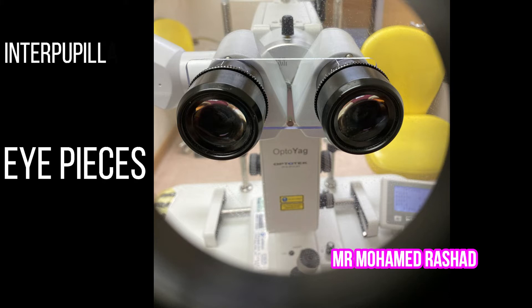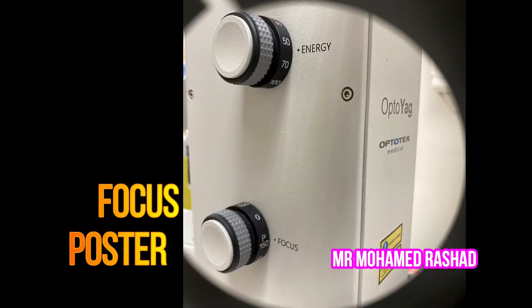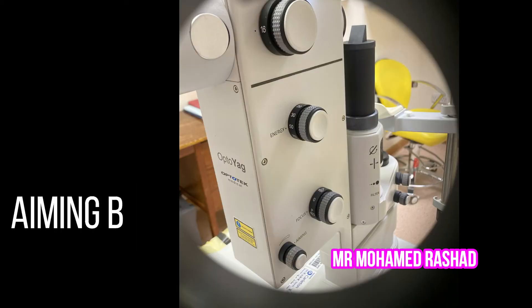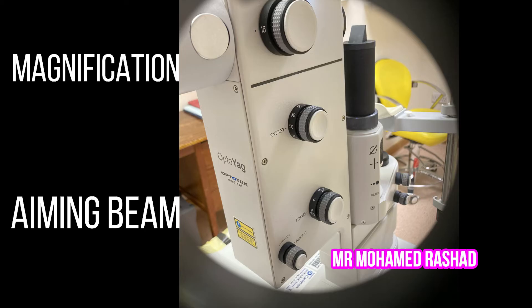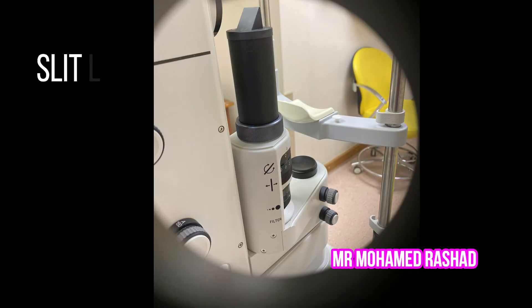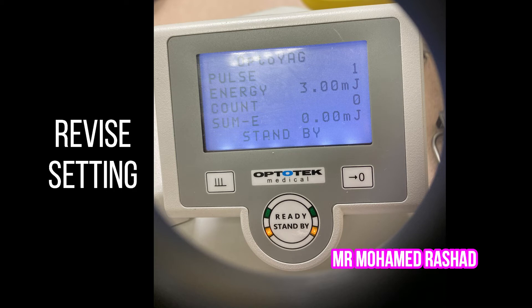You have to adjust your eyepieces — if you are using glasses, put it on zero — and adjust the inter-pupillary distance. The focus has to be posterior by about 150 microns, and the energy adjusted according to the situation. You also need to adjust the magnification, the aiming beam, light, the joystick for firing the laser, the slit lamp, and the settings: pulse is 1 and energy approximately 3 millijoules.